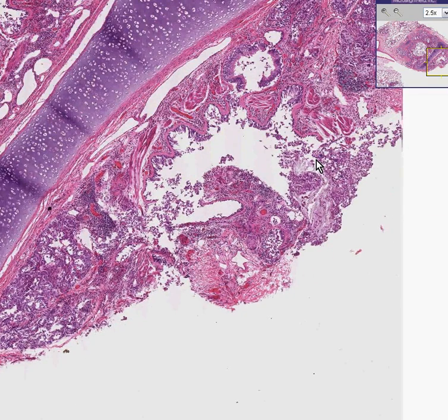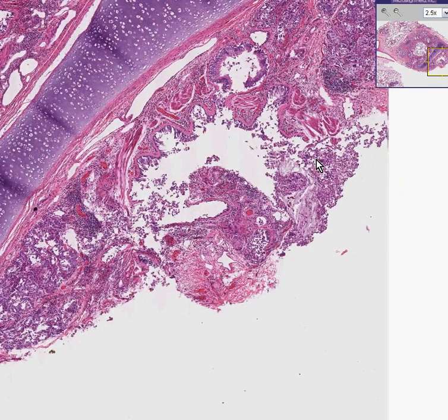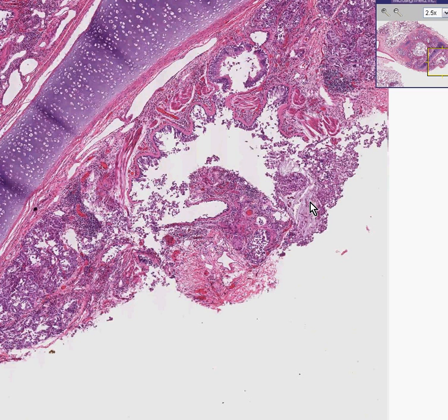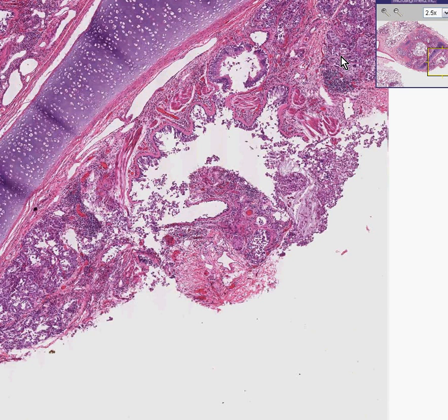Here's the smooth muscle thickening. Here's the chronic inflammation. Here's a mucus plug. Here are some submucosal glands, also inflamed as well.